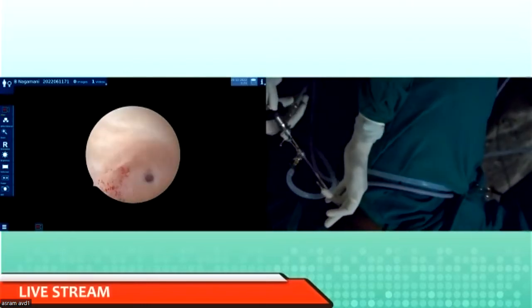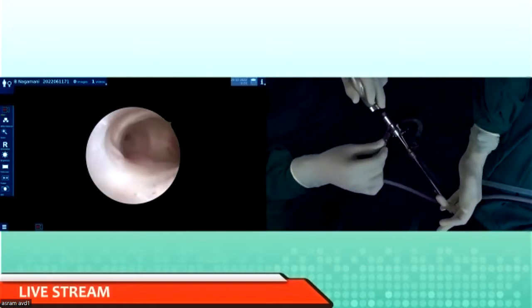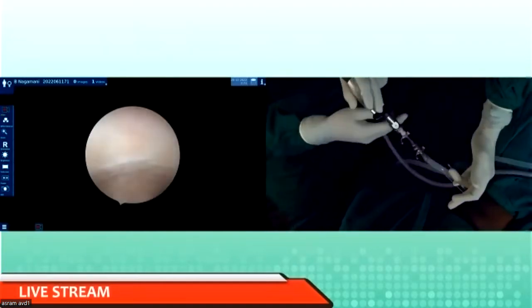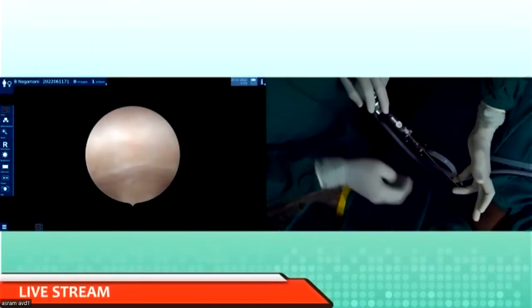Okay, this is the endometrium, and this is the atrophic endometrium, sir, and there's a small polyp. Can you see that? Are you able to see this polyp? Yes, we can see, sir. Now I'll just show you a few nicks of septal resection.